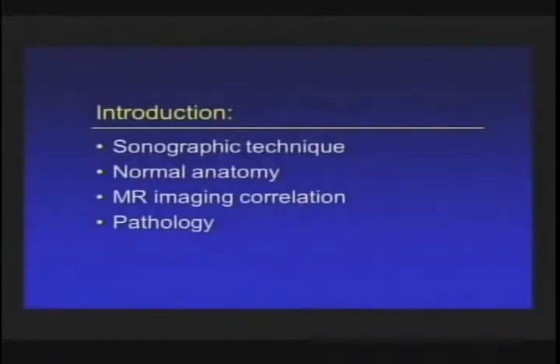So I'm going to review 4 different areas, touching a little bit on the technique and anatomy again, but then go right on to pathology and include MR correlation where possible.